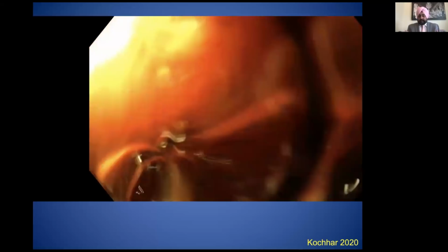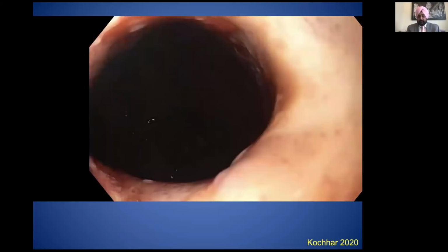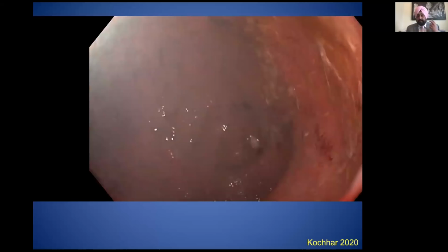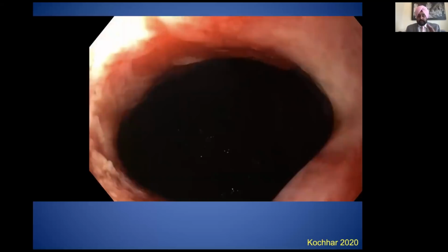And as you can see, the pouch is inflamed as there was fecal stasis. Patient was having symptoms. The stricture immediately looks bigger than before. I have followed this patient for almost a year now. She's had two repeated pouch exams with me. I did not have to do any more cutting. Stricture is still widely patent.